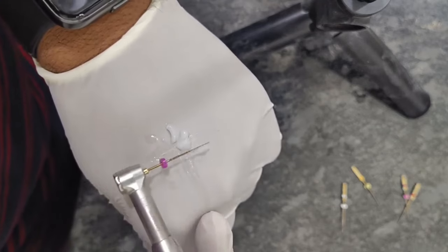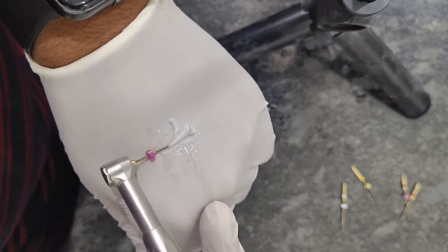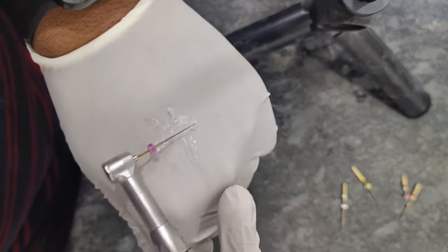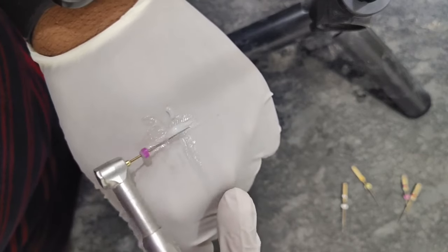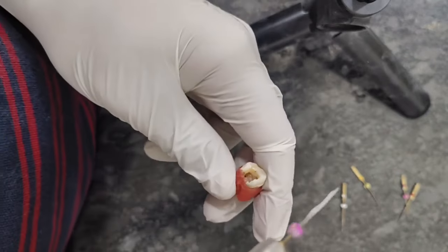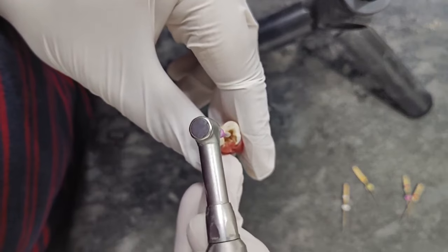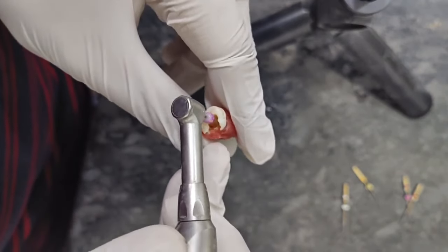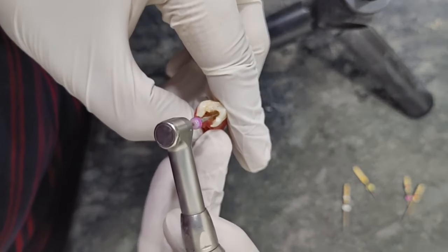So this is the first rotary file with variable taper, and this is the path file. You also get path files of many companies. This is the company Woodpecker, I think, and you will get them from VDW, or you can also get Dentsply path files, which are very easy to get in the online market. So you can see the canals here nicely, and so smoothly I am putting it inside the canal. So this is the distobuccal canal. You can see very smoothly it's going. Then again in the mesiobuccal.